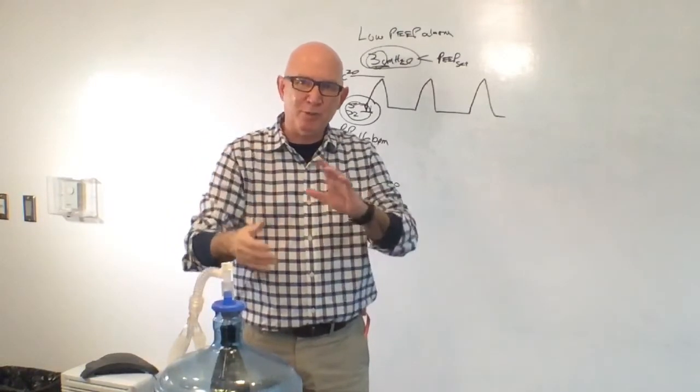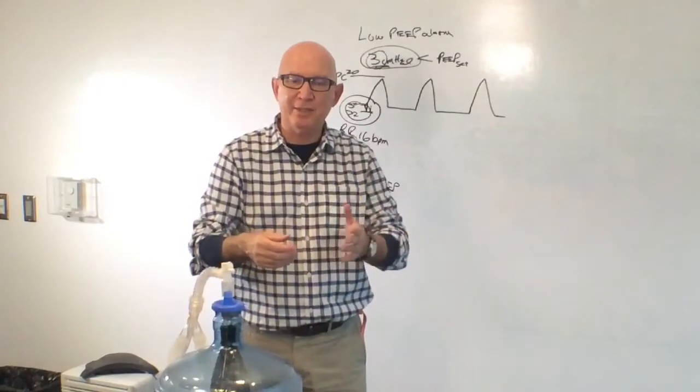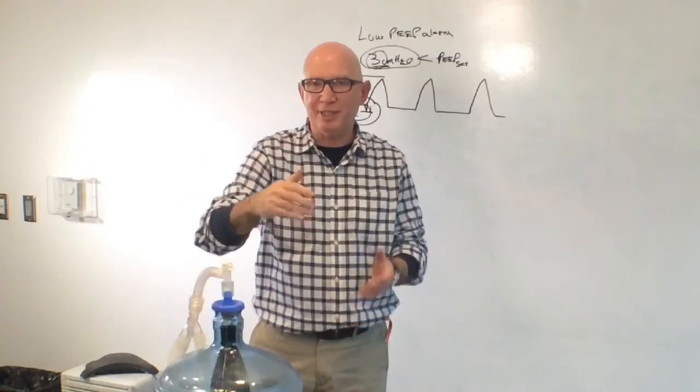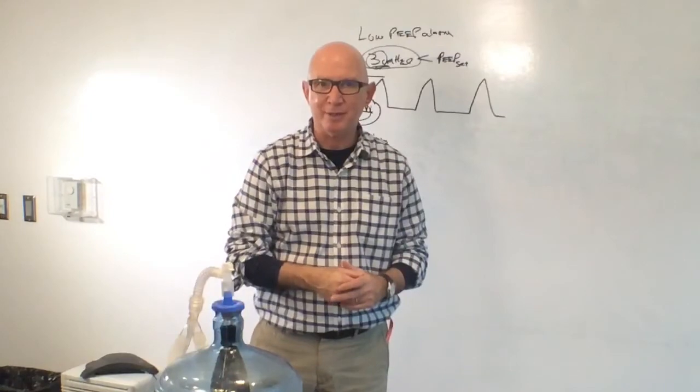And that goes both ways. So that's a 20% decrease in volume if your end-tidal CO2 dropped by 10, or a 20% increase, excuse me, if your end-tidal CO2 increased by 10. So just something to keep in mind in that regard. Okay.